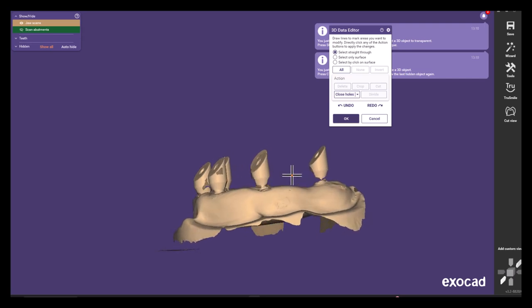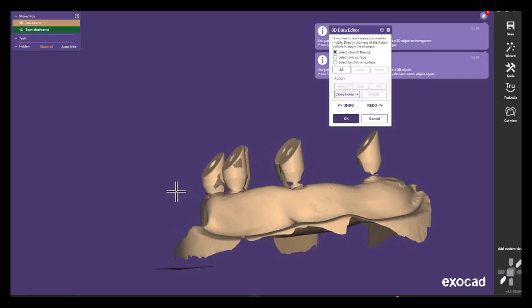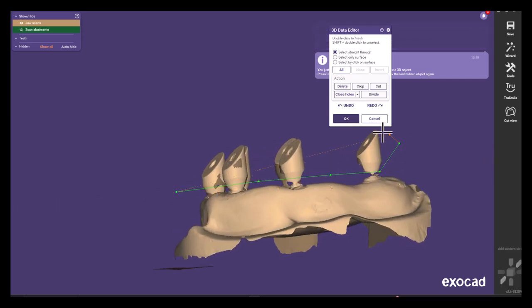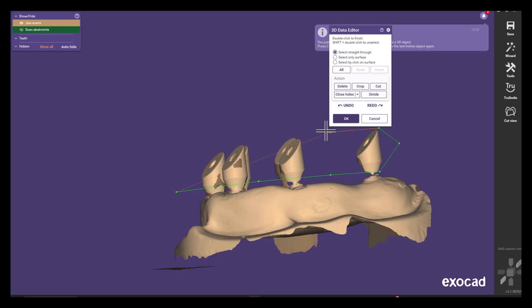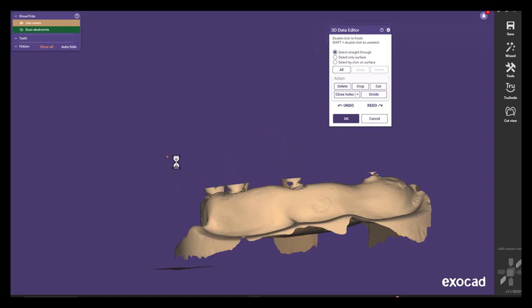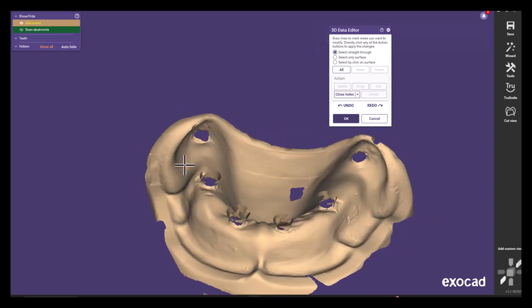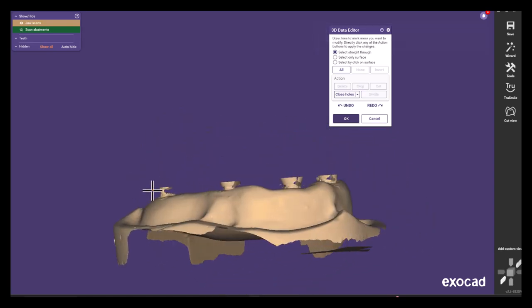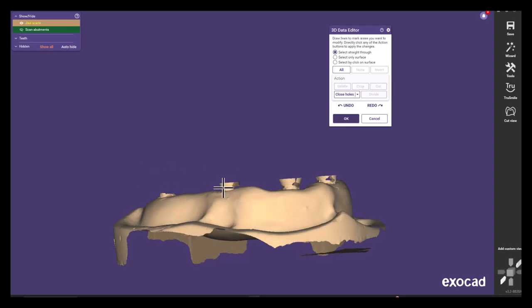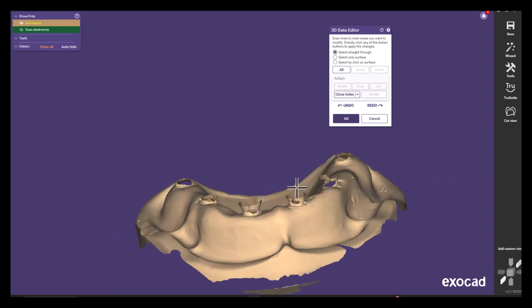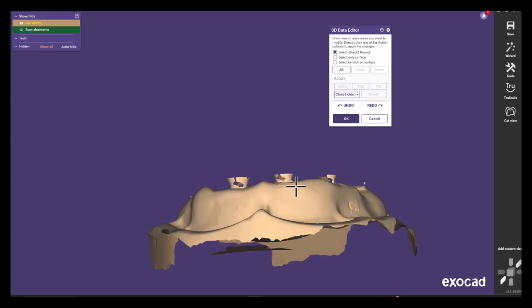And now you can cut all of the unnecessary data away and do some fine adjustments on the model as you wish. I recommend cutting all of the floating parts away as they may cause some issues afterwards in merging stage.